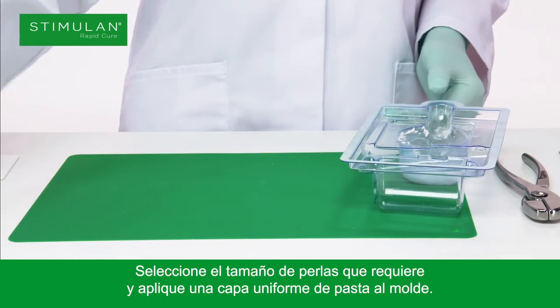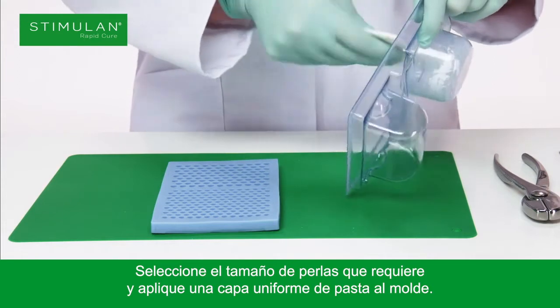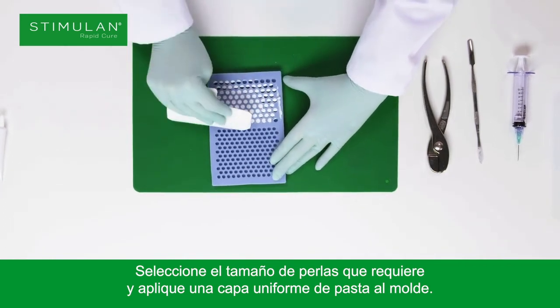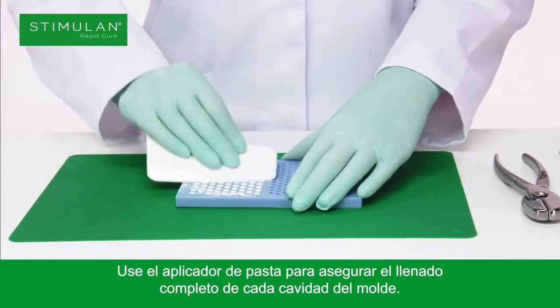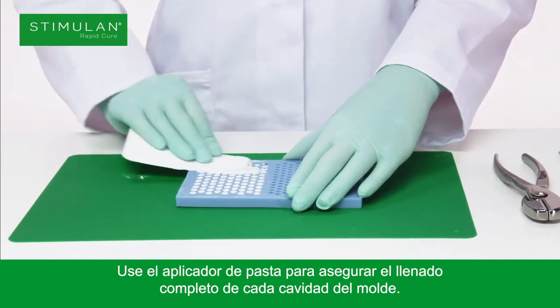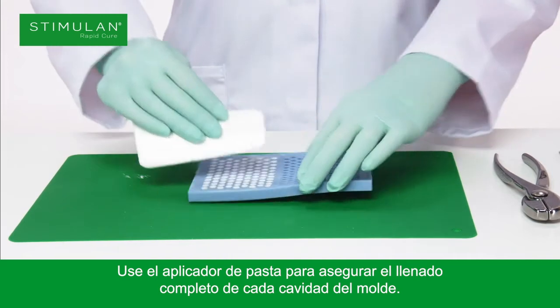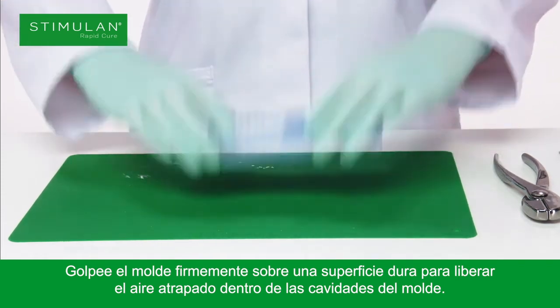Select the size of bead required and apply a uniform layer of paste onto the bead mat. Use the paste applicator to ensure complete filling of each bead cavity. Firmly tap the mat on a hard surface to release any air trapped in the bead cavities.